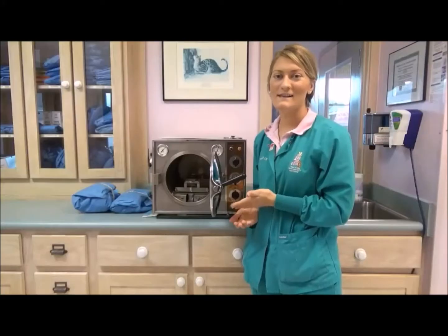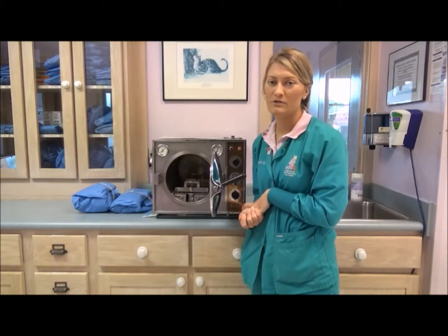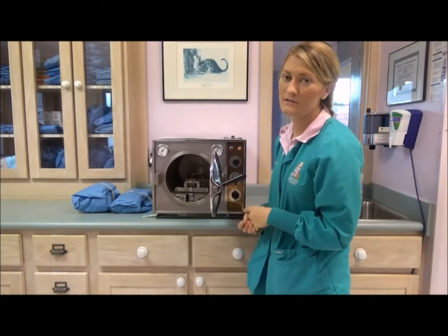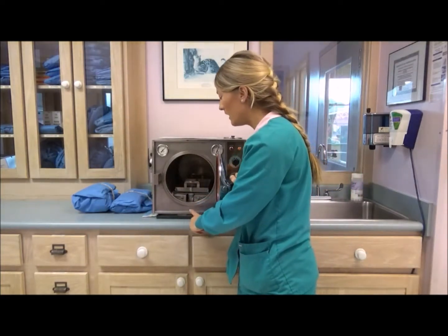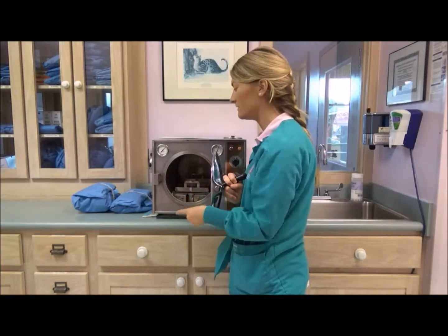All done. This is a gravity air displacement autoclave. It uses steam under pressure to kill microorganisms. Basically how it works is distilled water fills up at the bottom of the chamber here. And then that water gets heated up until it turns into steam.